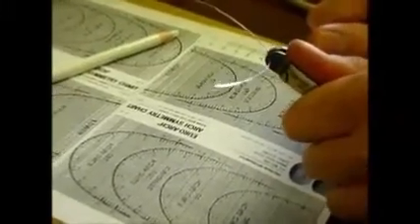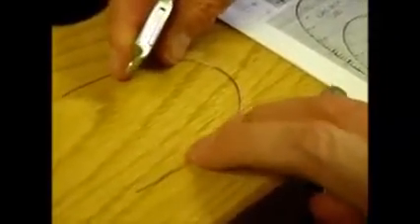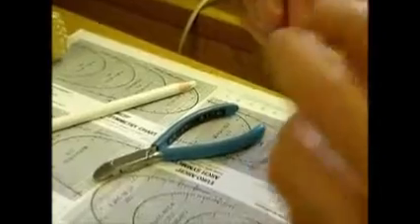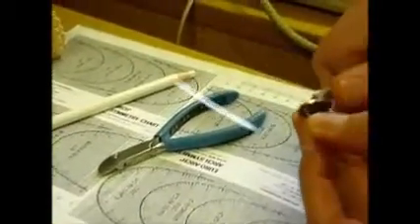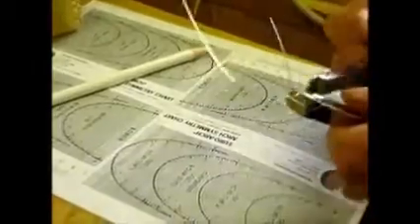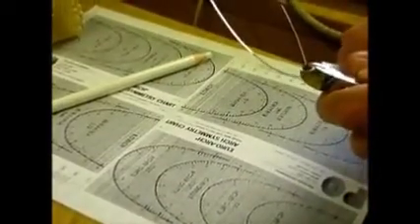But you know what, it's difficult trying to visualise what it is that you're trying to do to the wire. You're trying to make this like a cycle track, an indoor cycle track, so it's flat on the sides, and then it's banked up at the very front bit there, and then it's just a question of levelling it out. You really don't want to bend the wire behind here, you shouldn't need to adjust it, because it should still be the original flat arch form.